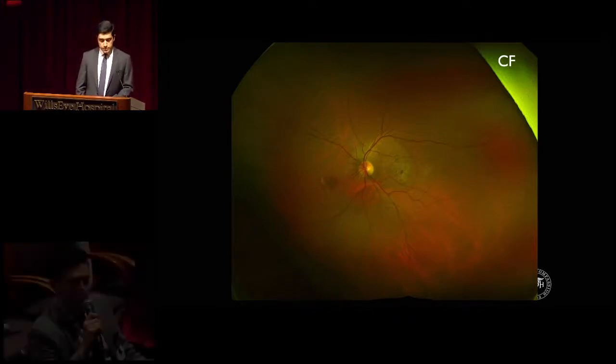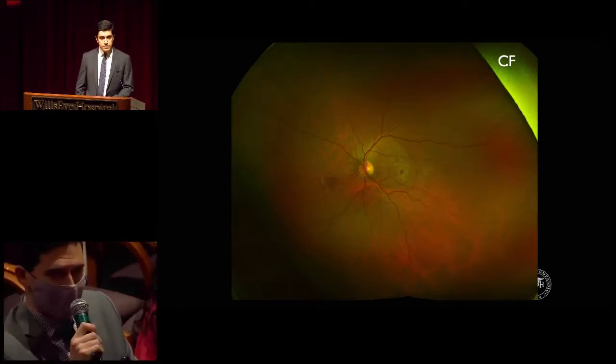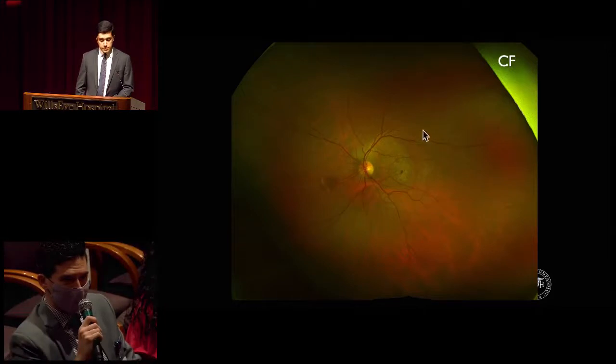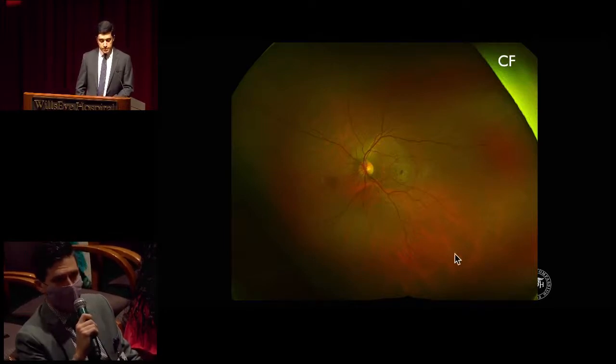There is notable retinal whitening in the peripapillary and macular region here, fairly well circumscribed. There is also either hyperpigmented or possibly subretinal hemorrhage here in what appears to be roughly the subfoveal area. And then in the near periphery, there's also this linear whitish lesion with what looks like might be subretinal hemorrhage adjacent to it. However, the mid and far periphery appear grossly normal. Perfect.